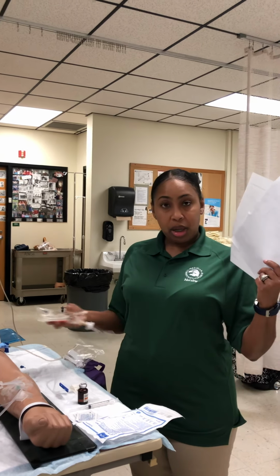Now I'm going to wash my hands, and I'm going to gather my equipment for my IV push and my IV piggyback at this time. So, washing the hands. For the IV push, we're going to gather a syringe. I'm giving 3 milliliters, so I'm going to gather a 3 milliliter syringe. I'm going to gather my furosemide, my alcohol swabs, and for my gentamicin, I will gather my gentamicin. It's labeled. I'm going to check the expiration date. It expires September 2020. I'm going to check for any particles, any cracks. I'm going to also check my tubing.